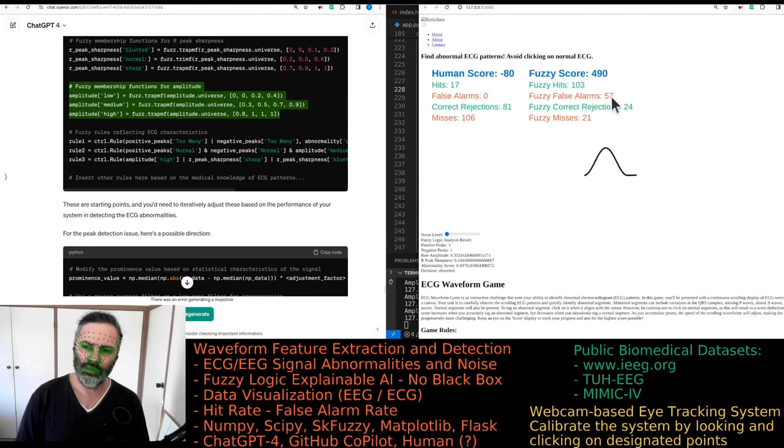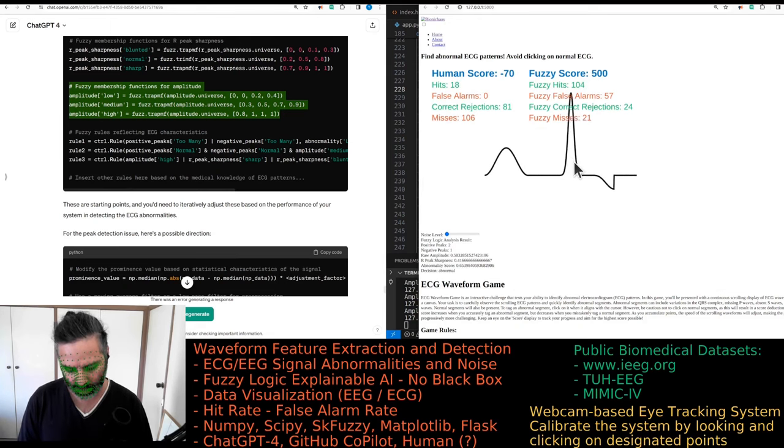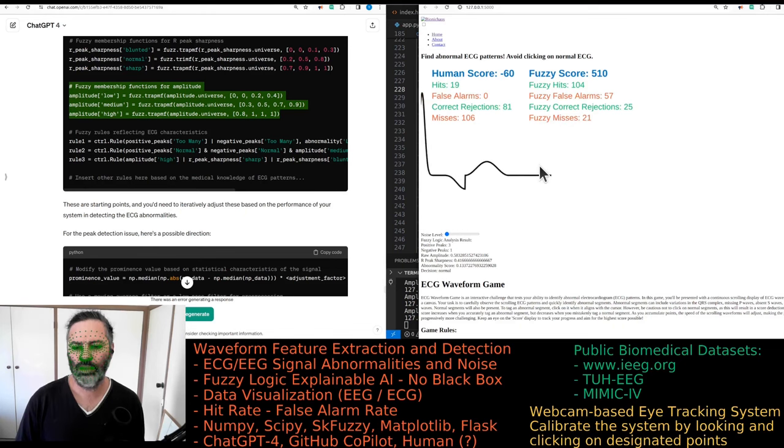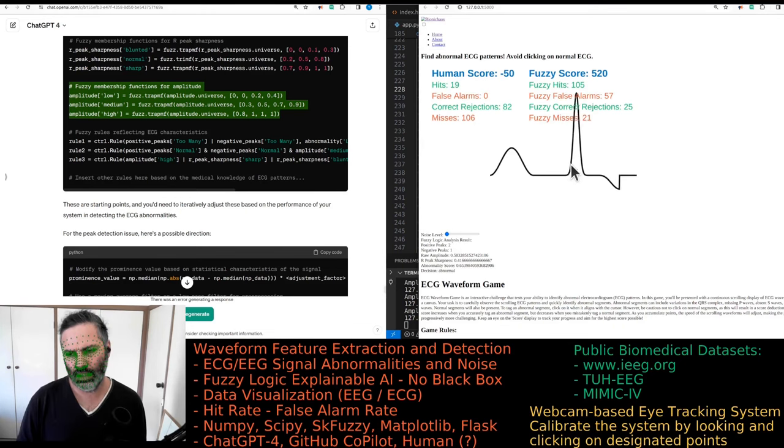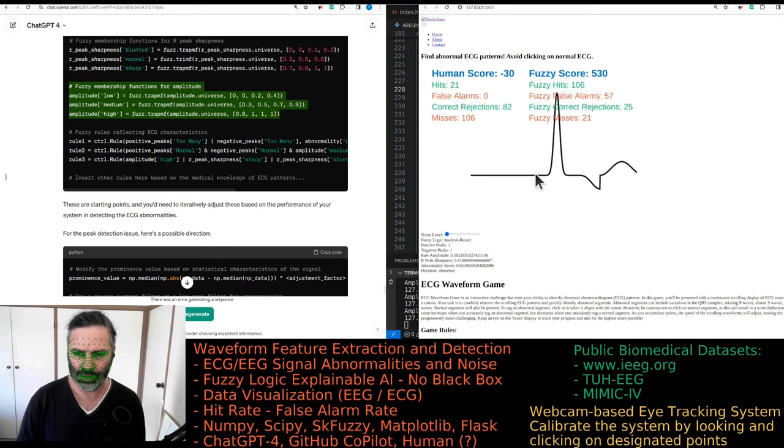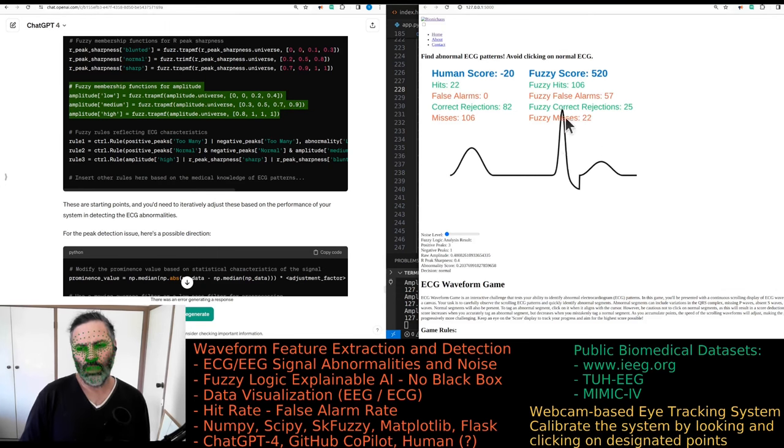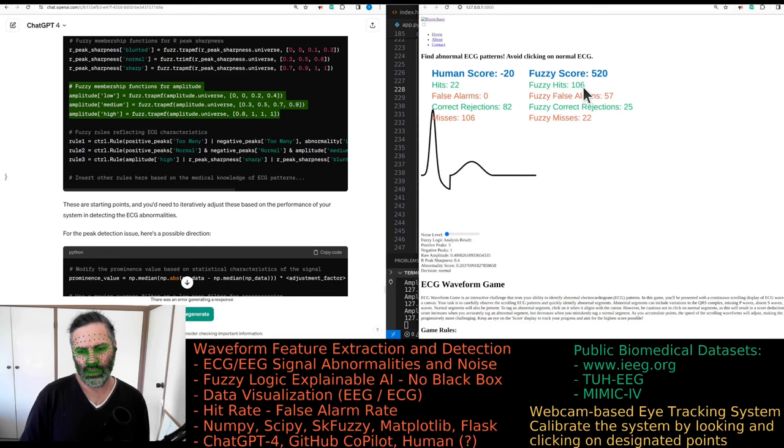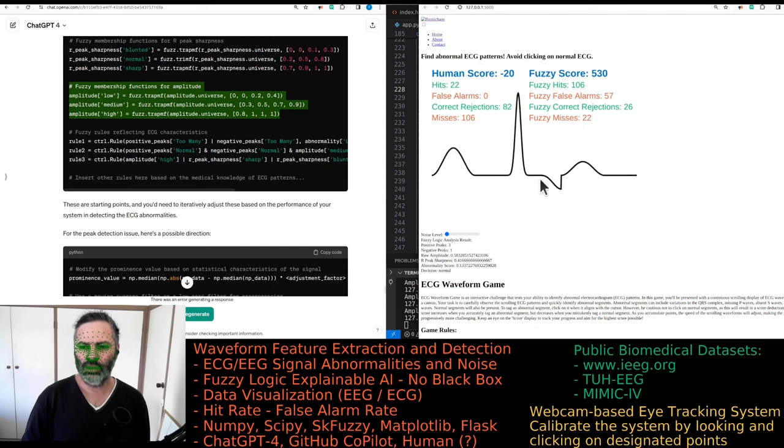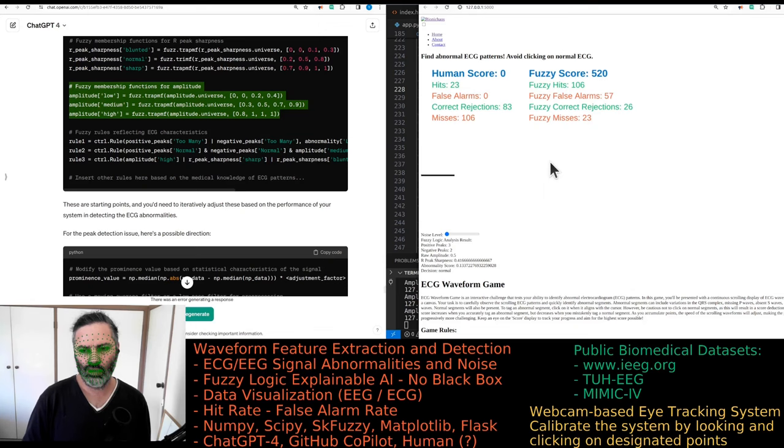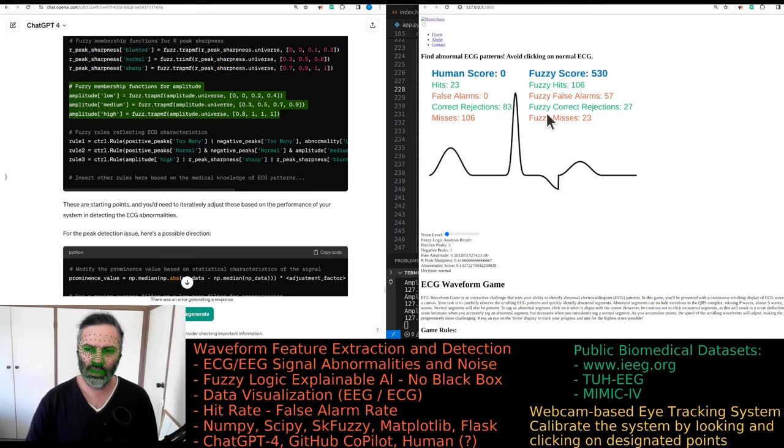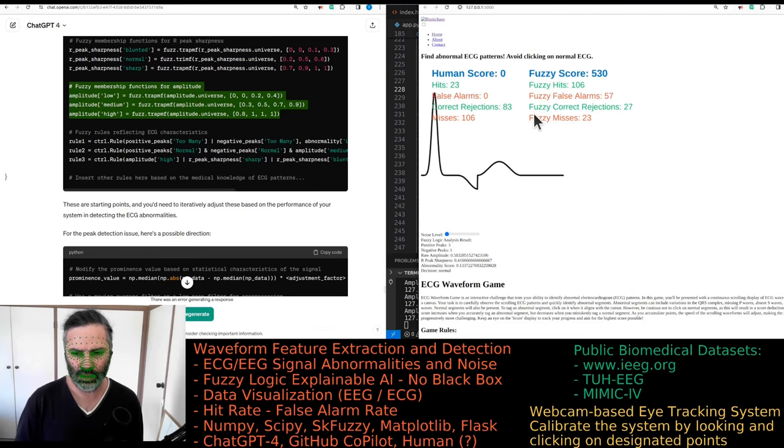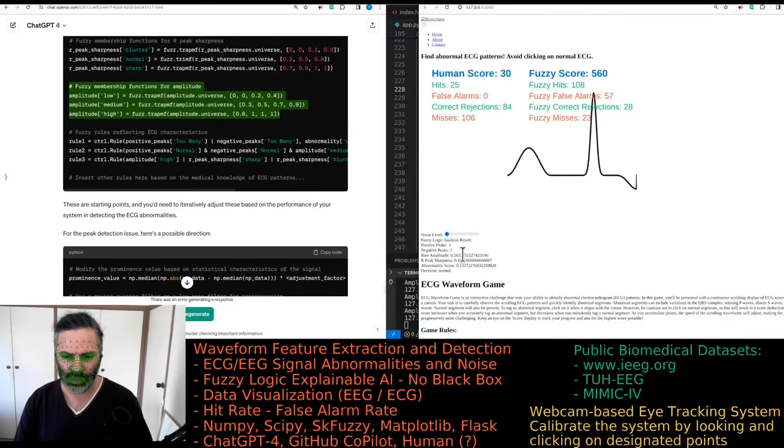So we have no noise. The fuzzy logic is doing pretty good. I think it might not be making any mistakes whatsoever. For the demo we might just add a low amount of noise where it does make mistakes sometimes. No, I just missed, so it was an abnormal waveform and it didn't click on it.